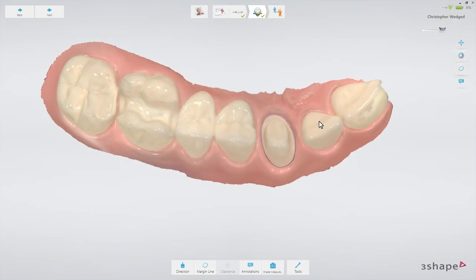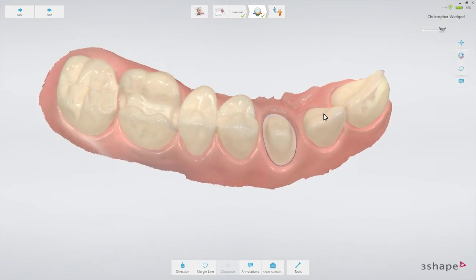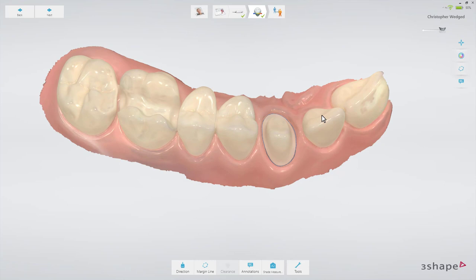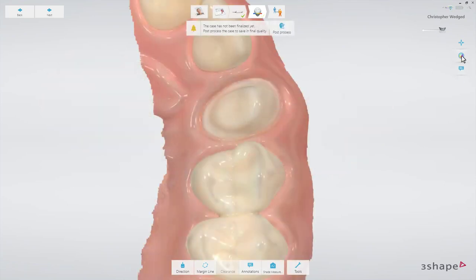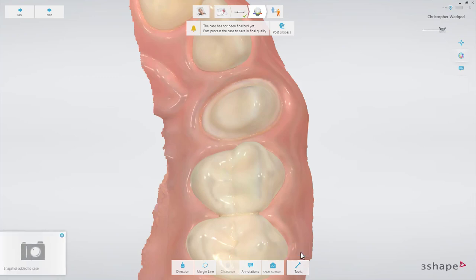If you wish, you may also see the difference on your own system. Here's what to do. On the analyze page, take a snapshot of the preview. To do that, select the tools menu and choose the snapshot button.